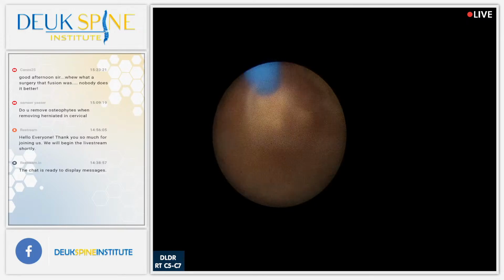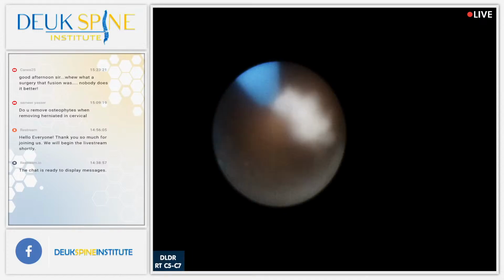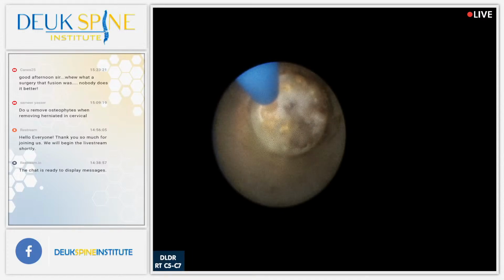Almost wish I had the lumbar scope. You know? The short one that we use for the... Unfortunately, we didn't get any dye in this disc, so we didn't get to stain it blue. So you can't really see the herniation, but that's it. It's just white.